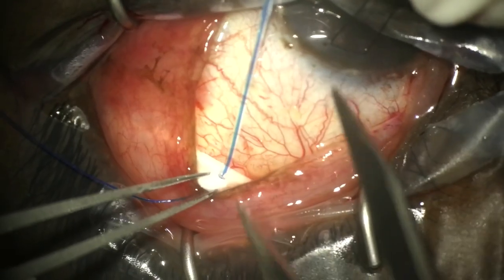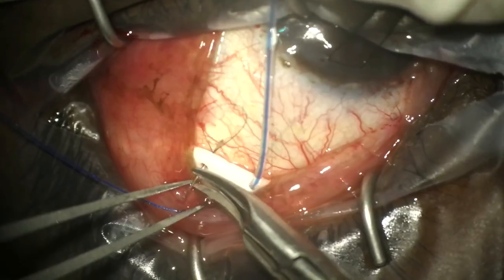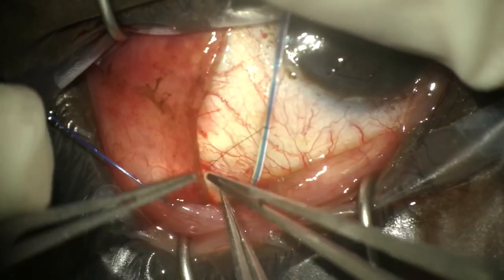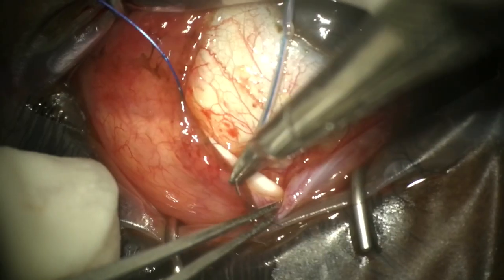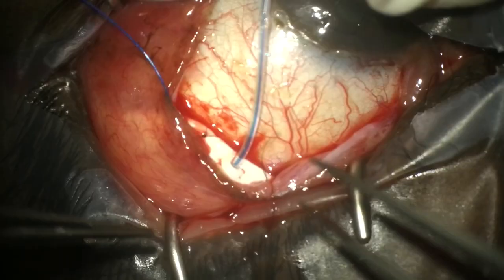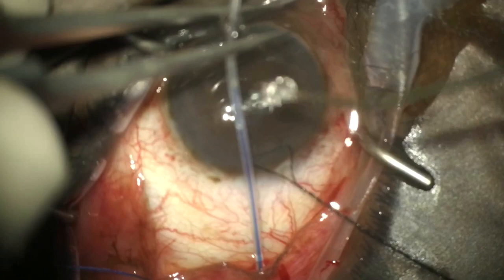We measure 10 millimeters back and secure the plate with 10-0 nylon sutures through the eyelets on both sides to prevent any movement. We suture the second eyelet so that both are now secured, and then check that the plate is secure.